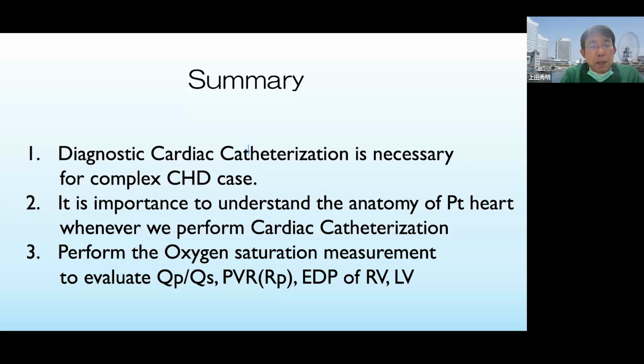You have reported many intervention cases very successfully. So I think the next thing to help save the life of the HLHS, oxygen saturation measurement should be very important and should be mandatory to proceed to the next operations or interventions.